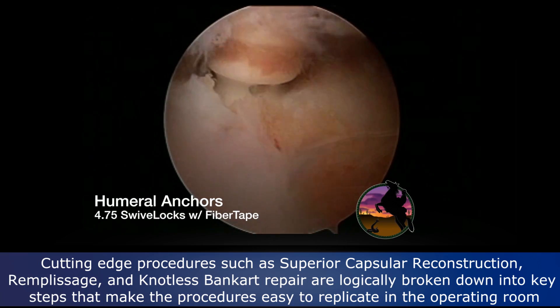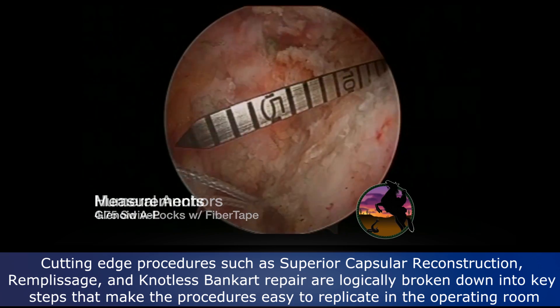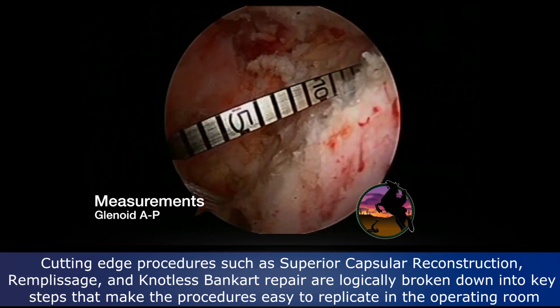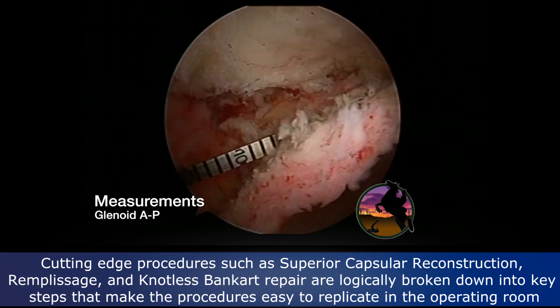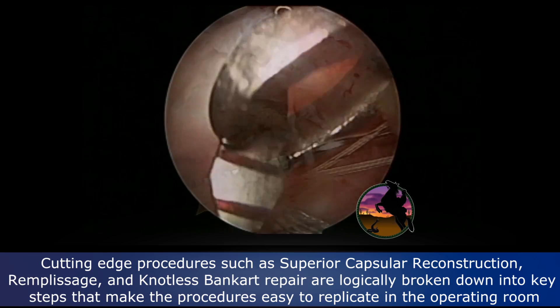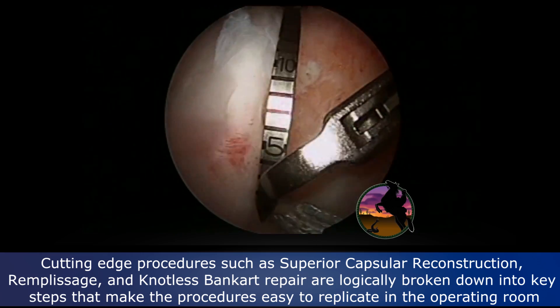We place two medial swivel lock anchors that are preloaded with fiber tape. We then measure with this calibrated probe the distance between all the anchors so that we can use that to size our graft and get it very accurate.